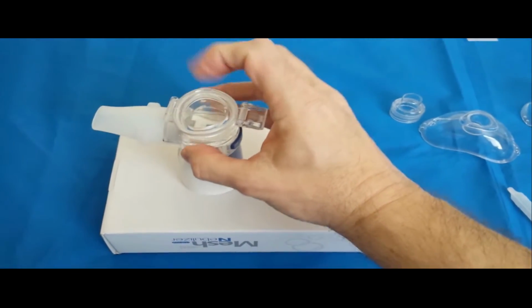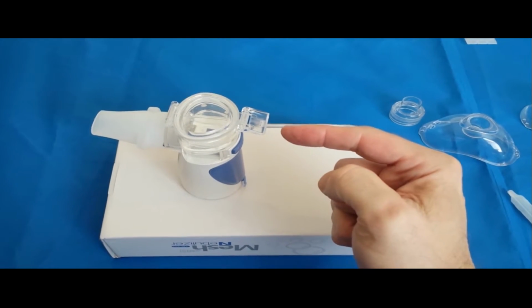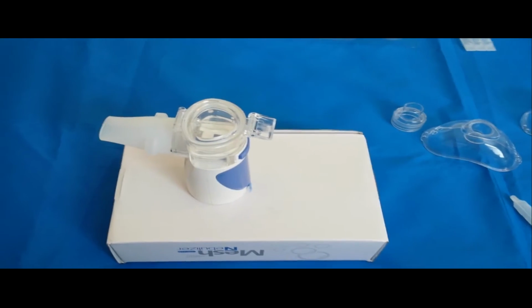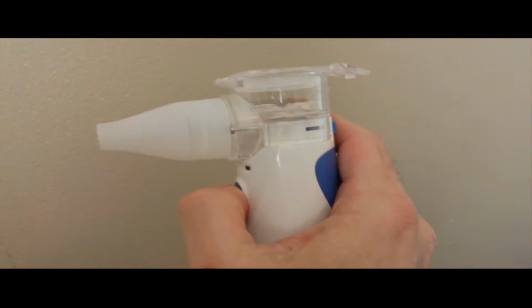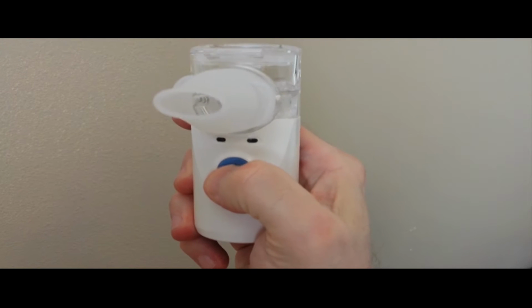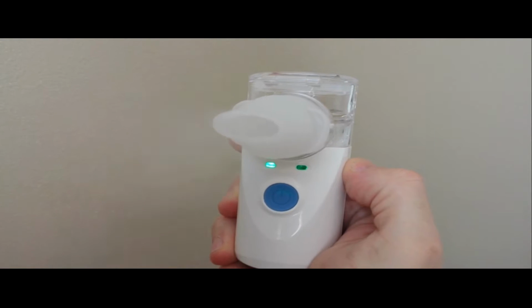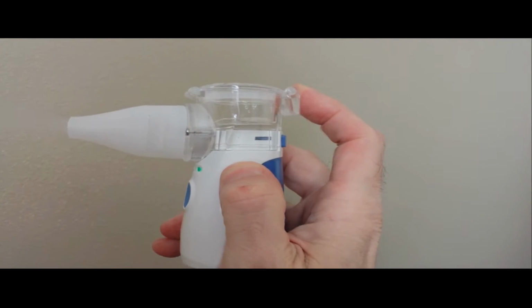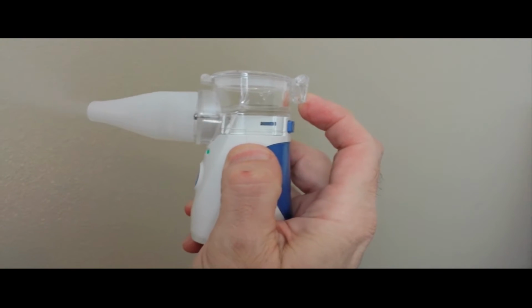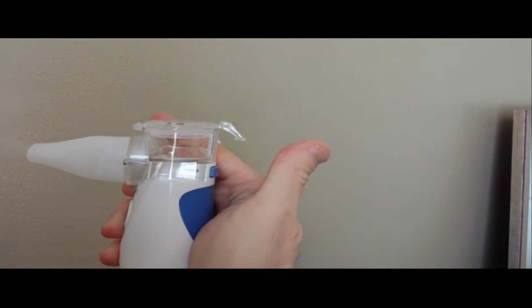Fold this down. Technically, this tab should be put down all the way, but I'm going to try it without pushing it down all the way because I'm kind of old and it's difficult for me to see. But then we're going to take it over here and just press that. And you can see already the mist coming out of the machine. So it will work without this being down all the way. Again, technically it should be pushed all the way down. And then to get it up, you've got to kind of clip it out.